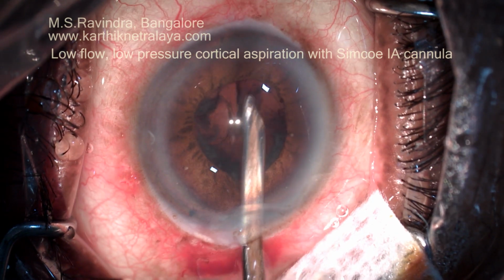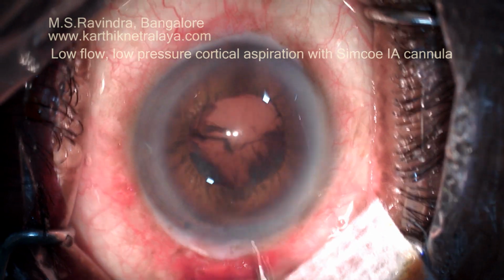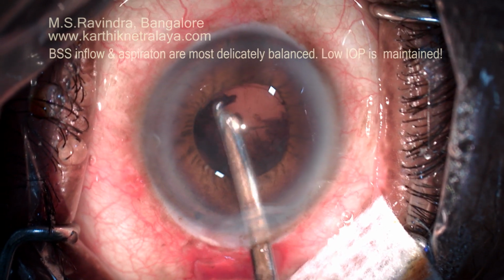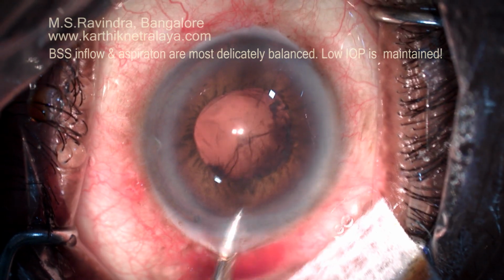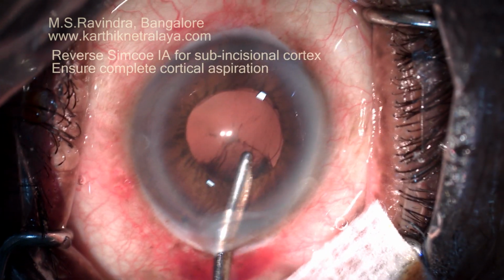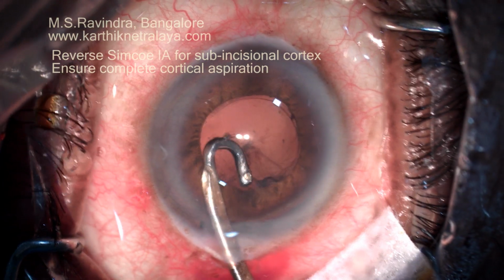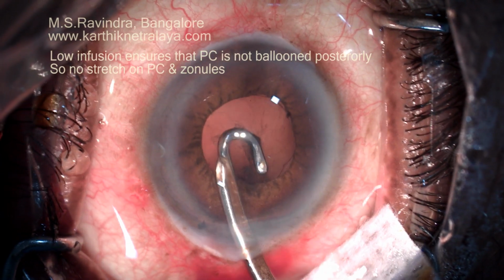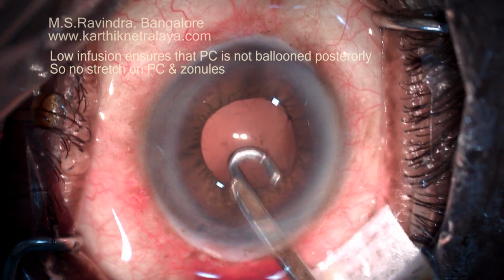Meticulous control of intraocular pressure is possible with the Simcoe infusion aspiration cannula. The infusion is also not continuous. It's controlled by the fingertips of the surgeon using the silicon bulb. So meticulous control of intraocular pressure is possible as both infusion and aspiration are under the direct control of surgeons, guided by the microscopic view of the status of anterior chamber during surgery.